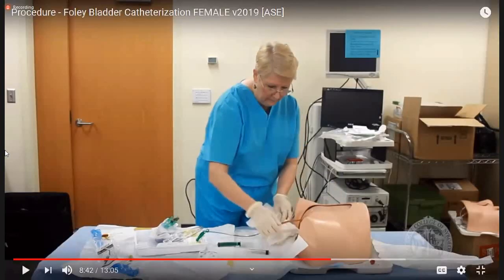Okay, once the urine is noted, then inflate the balloon with this sterile water and then pull back the catheter to the confirmation and feel the resistance. If you feel the resistance, it means the catheter fits around the bladder neck.